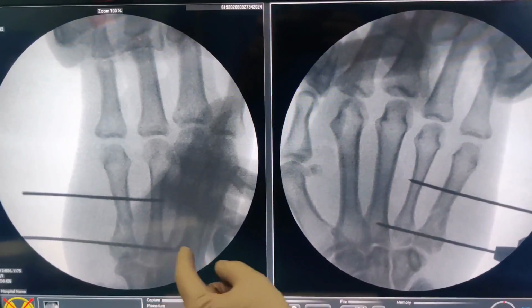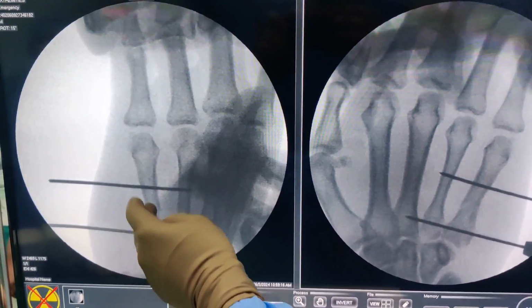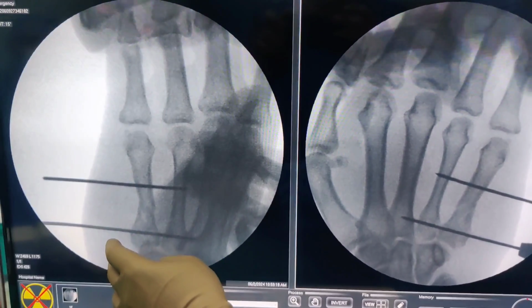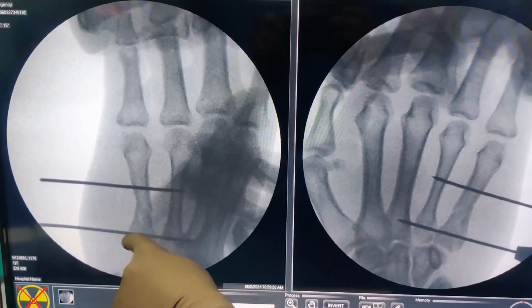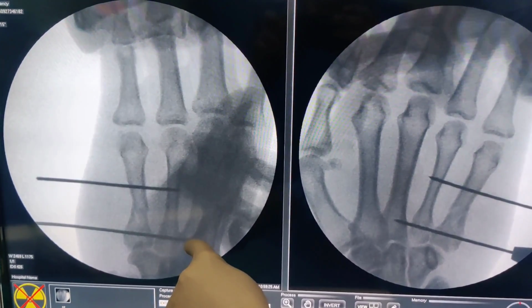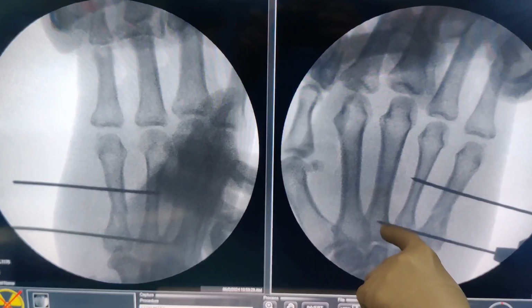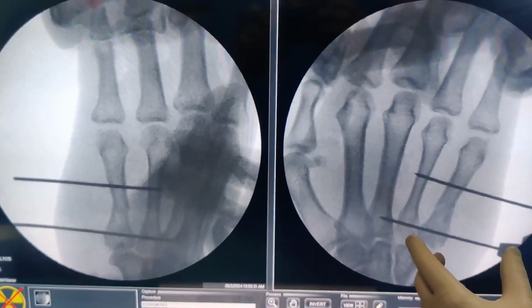If you look at this image, this is the one taken oblique. The alignment is reasonably acceptable. You don't have to be perfect. Here we have got 4 cortex. Here I was lucky enough to go into the base of the third. You don't really have to go there, but if you want, same here, we have gone into the base of the third as well. It just makes the construct slightly more solid.